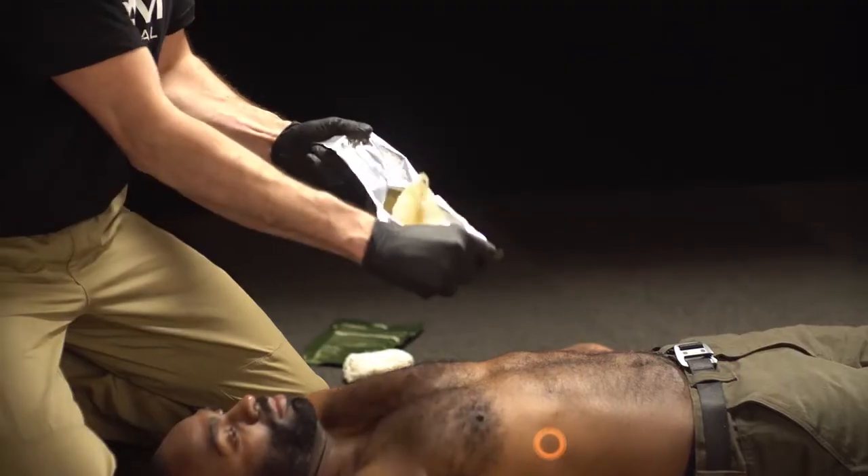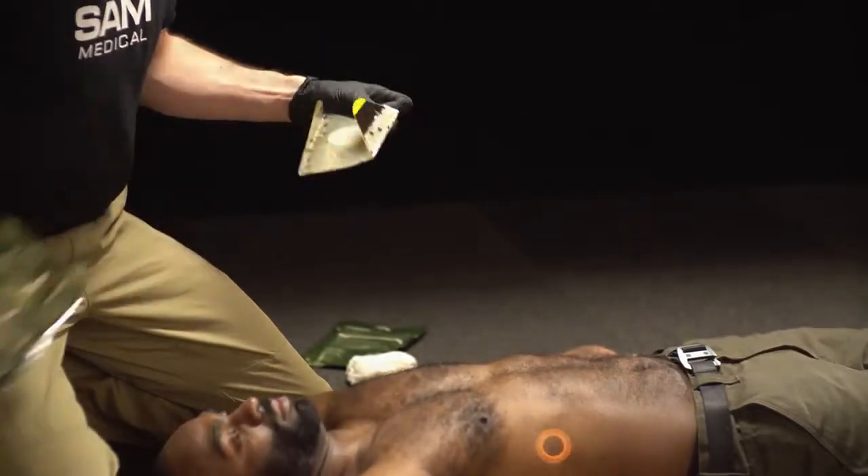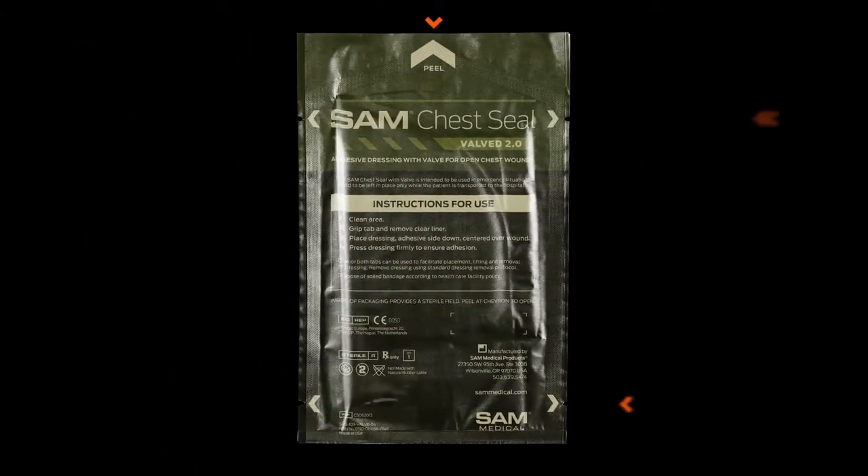Quickly and easily open the sterilized SAM Chest Seal packaging by peeling it from the tabs or tearing along the chevron-marked notches.